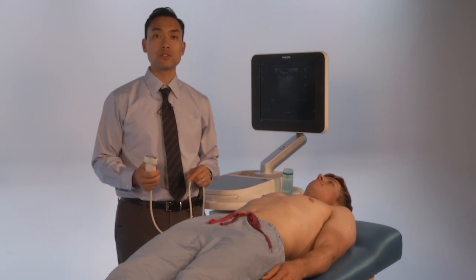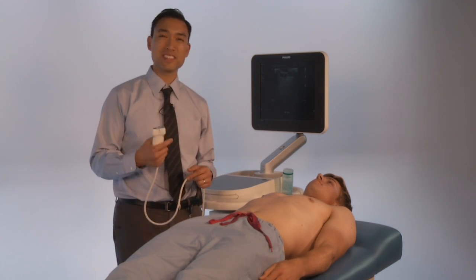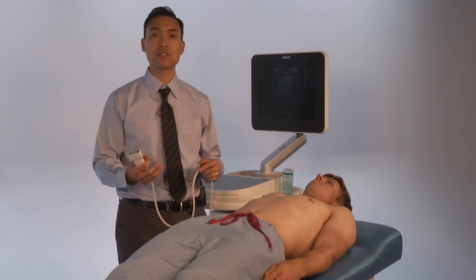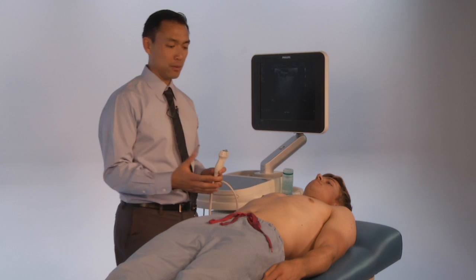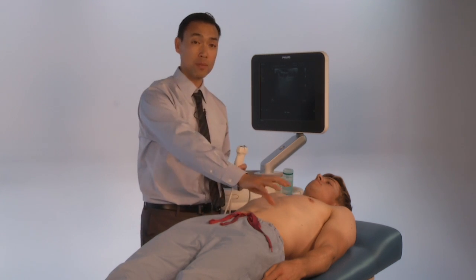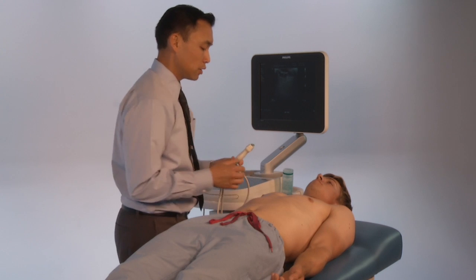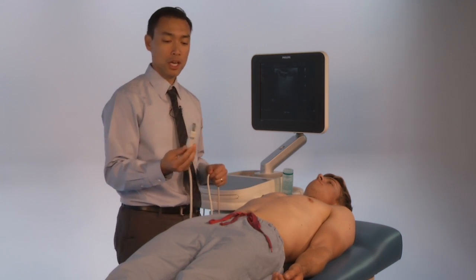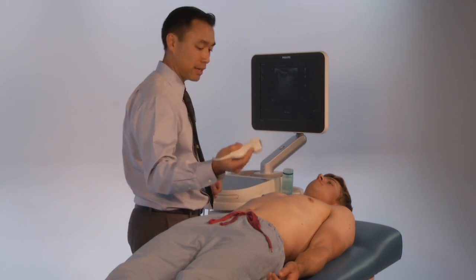In this video we're going to use ultrasound to assess musculoskeletal structures — specifically the skin, the muscles, and nerves — and how to differentiate between those. We're going to use this patient's left forearm as an example. For musculoskeletal ultrasound you're going to use a linear probe, which has the best resolution, and you put it on musculoskeletal setting.